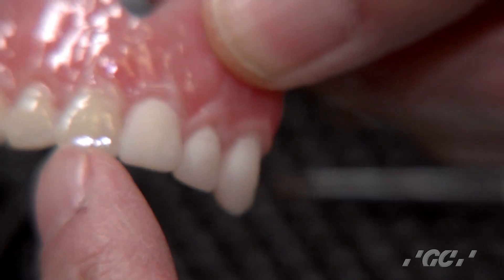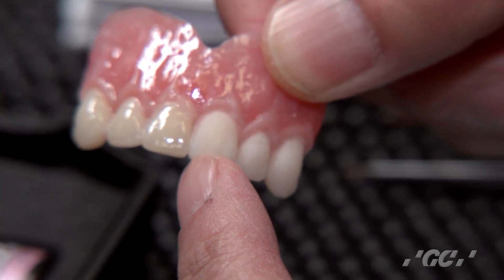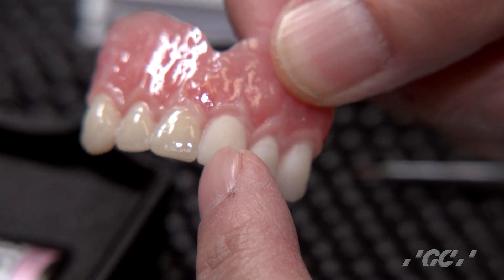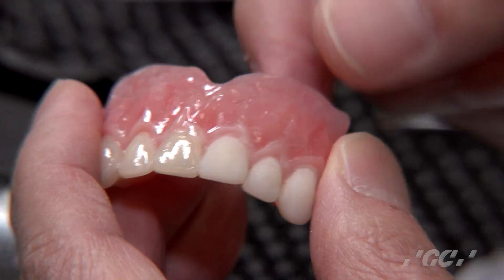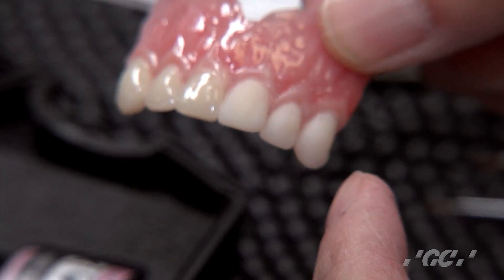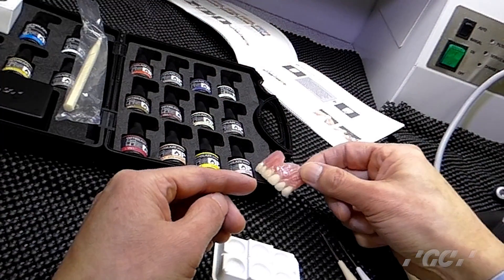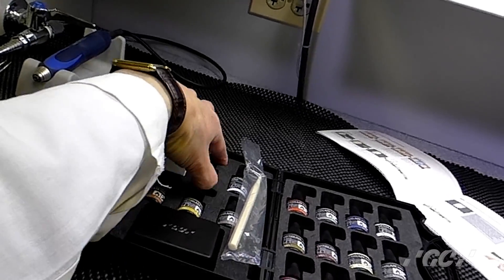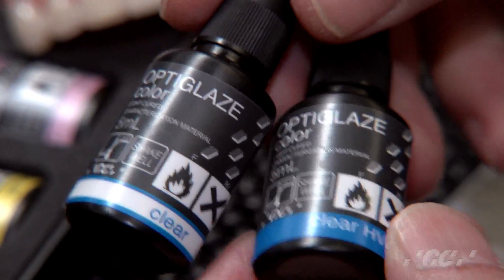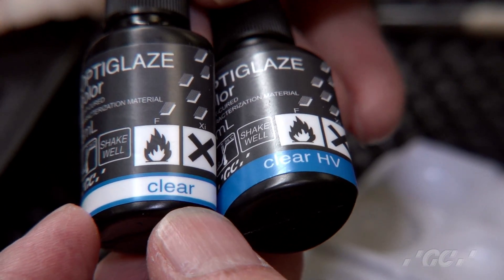This is the original color. Before you apply the OPTIGLAZE color, I'd like you to sandblast the surface of the dentures. At this stage it is very dry, so you cannot see the true colors. We have two different clears: one is a clear, which is a very thin layer.